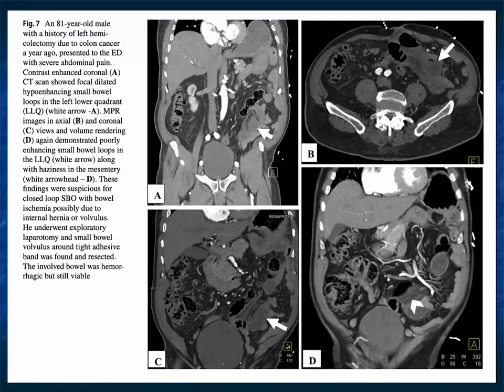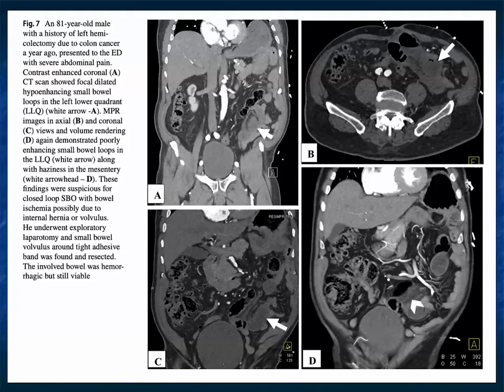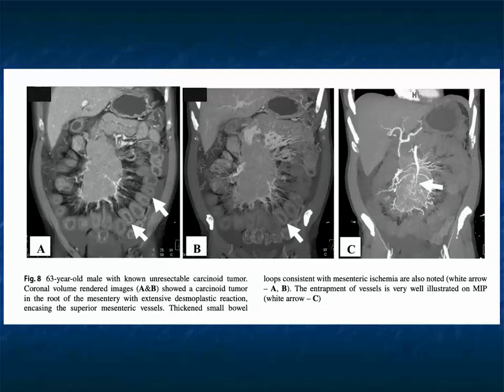Here's another example: a patient with left hemicolectomy for colon cancer presenting with abdominal pain has obstruction with mass effect on the left side of the abdomen. You'd worry about internal hernia or possible recurrent tumor, but a tight band was present causing volvulus. The bowel was hemorrhagic, but because it was caught early enough, the bowel was viable and the patient survived. Here's a patient with a carcinoid tumor with desmoplastic reaction — you can see thickening of the bowel. Carcinoid tumors can lead to ischemic bowel because of this desmoplastic reaction.